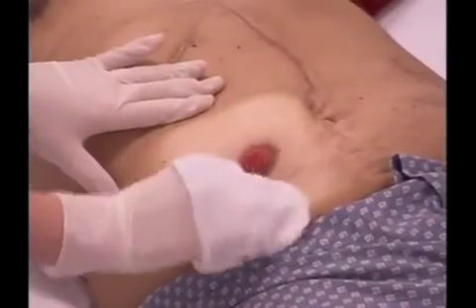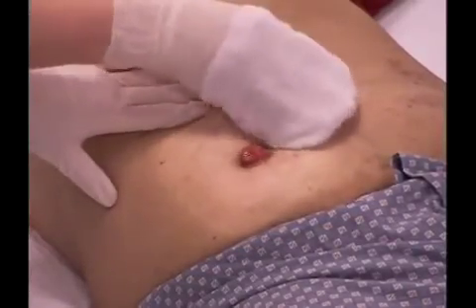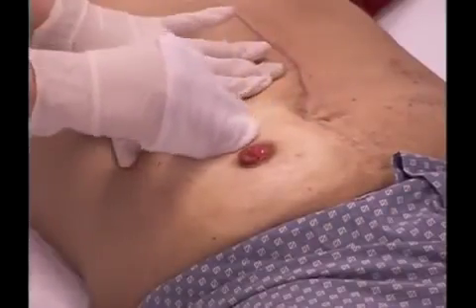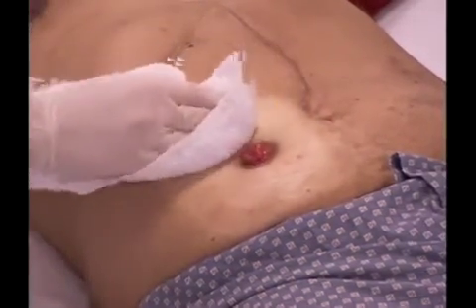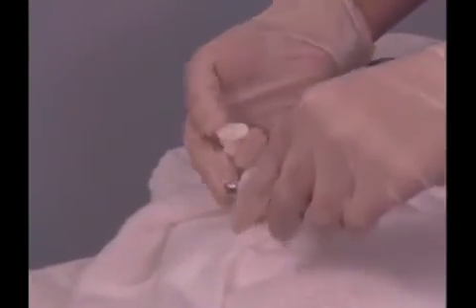Clean the skin around the stoma. Rinse the skin around the stoma thoroughly. Then dry. Apply the skin barrier if needed and allow it to dry.